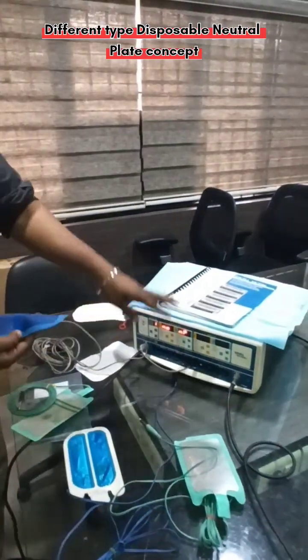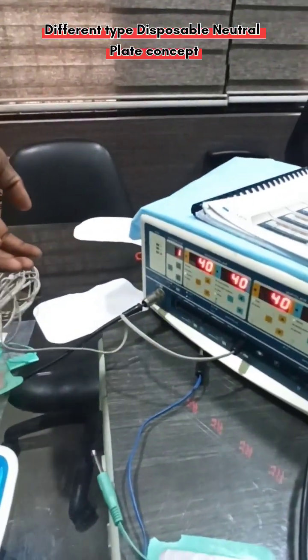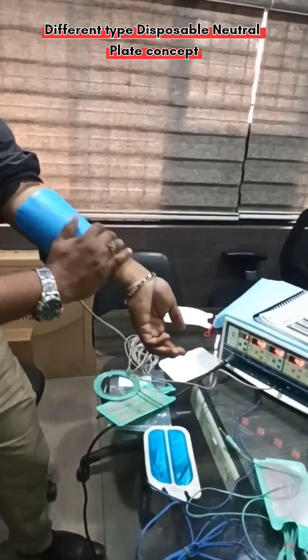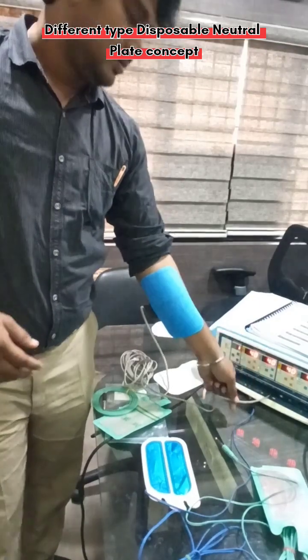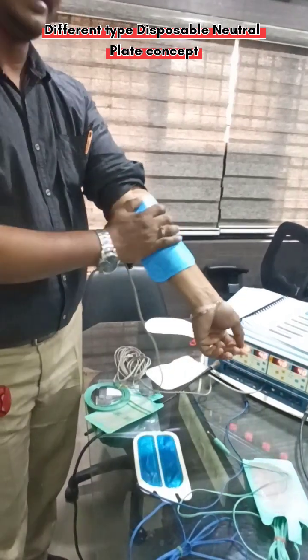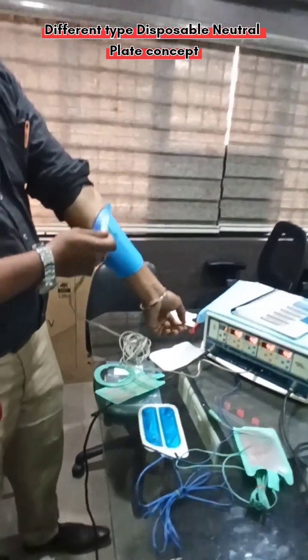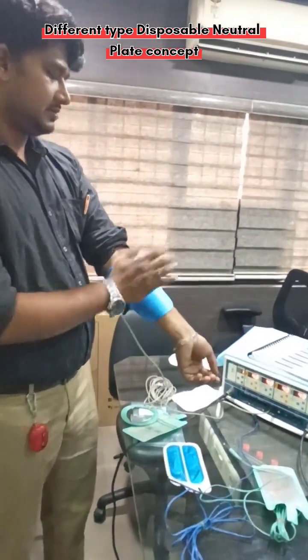This is a disposable split-type plate, so again it will show an error. What you have to do is place it over the patient — only then will the error alarm stop. Once you connect the plate and place it on the patient body, the error will stop. If the patient plate is partially removed during use, the error will definitely come again. Thank you.